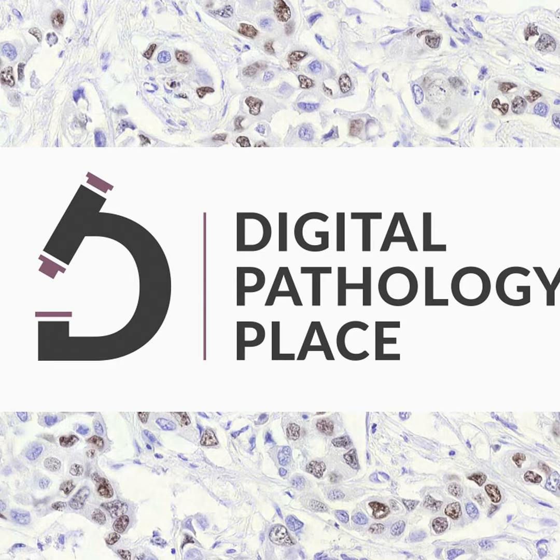we are gonna recognize these glomeruli in many different shapes and forms. So anyway, there's always this discussion, like, how come this domain shift influences so much, and how come you have to test this always if it looks the same? Well, it doesn't look the same. That's why we need to test. And the question is here, okay, is a lightweight self-supervised learning framework going to be good for domain generalization. There is a surprise in this abstract. I was smiling when I realized this surprise.